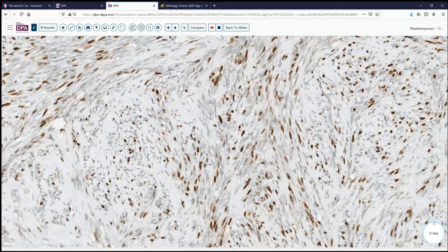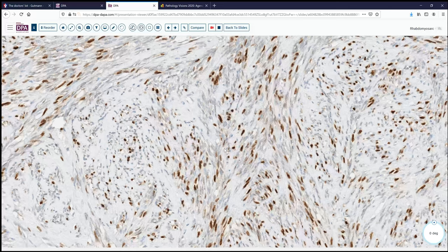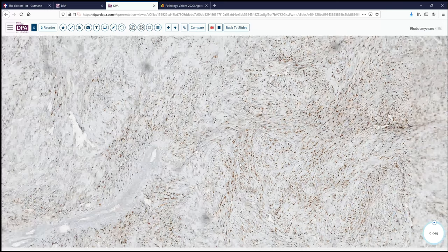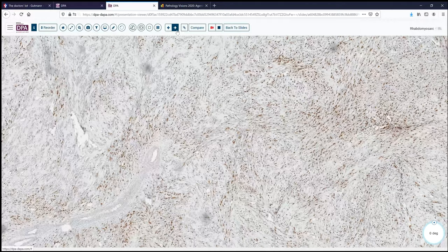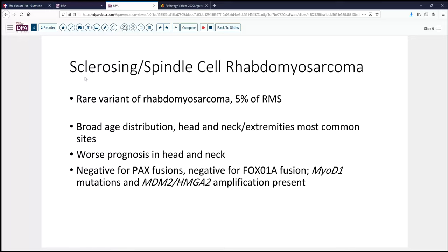Other stains that were done: desmin showed some positivity in this tumor; S100 was negative, excluding most of the nerve sheath tumors. PAX fusion genes were also tested. Our leading consideration is that this is a sclerosing or spindle cell variant of rhabdomyosarcoma — a rare variant, perhaps accounting for only 5% or less of all rhabdomyosarcomas.